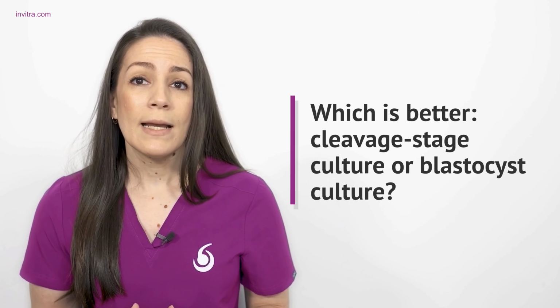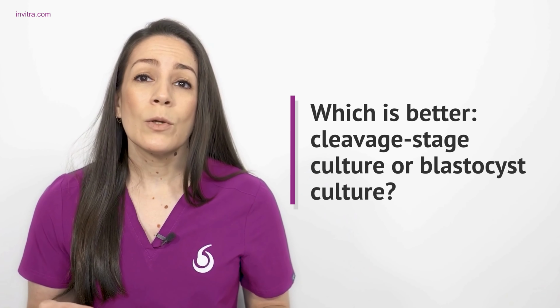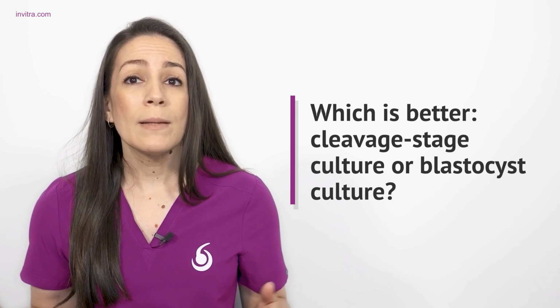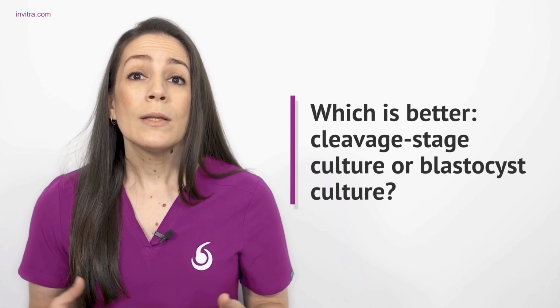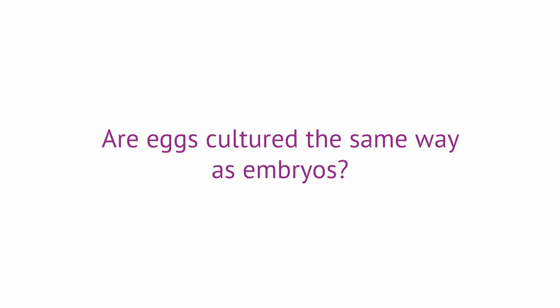On the other hand, extending the culture to blastocyst acts as a natural filter. It allows us to choose more precisely, since only the embryos with the greatest capacity to implant reach that phase. Ultimately, the ideal choice will be the one that best fits the history and unique characteristics of each patient, although the current trend is to transfer a single embryo at the blastocyst stage, long culture, due to the good results it offers.